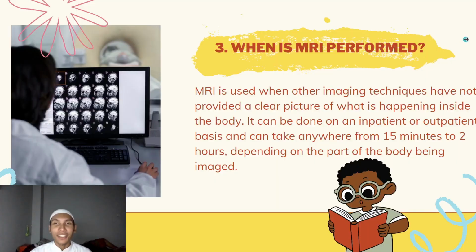Assalamualaikum warahmatullahi wabarakatuh. Alright, on to the third discussion on when is MRI performed. MRI is used when other imaging techniques have not provided a clear picture of what is happening inside the body. Other imaging techniques, for instance, are X-ray and CT scan. X-ray and CT scan fall short when compared to MRI. MRI provides a clearer picture of images of ligament, muscle and tendon.